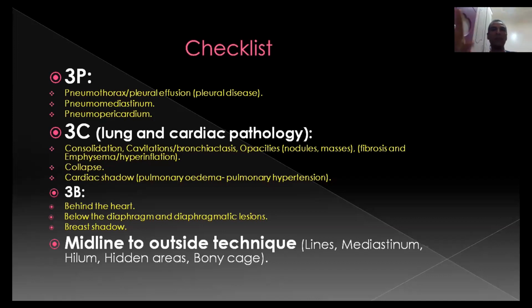Regarding the ultrasound, yes, ultrasound has a role to diagnose some parenchymal changes, but it's not commonly used and it's operator dependent. The most sensitive role for ultrasound is if it's associated with a pleural effusion or something like this.